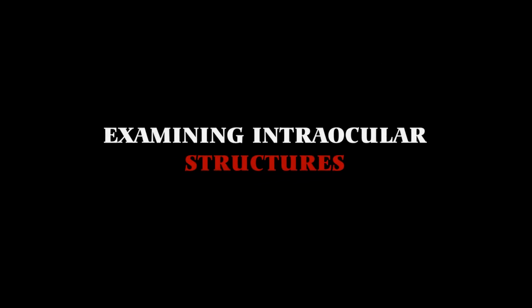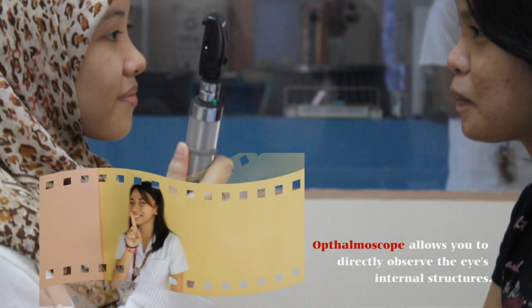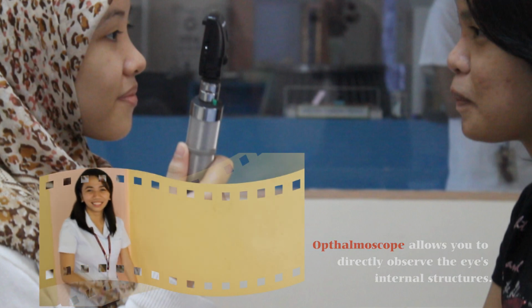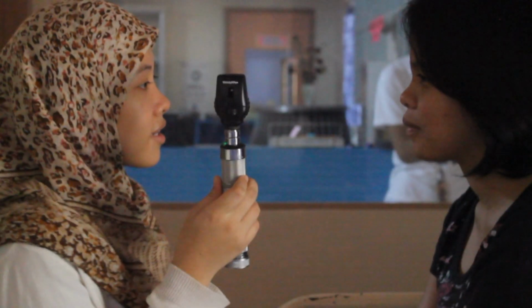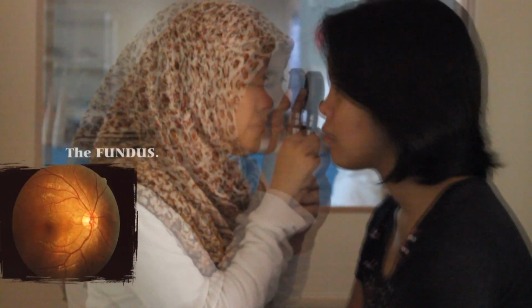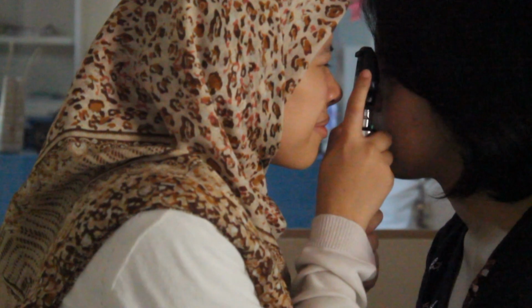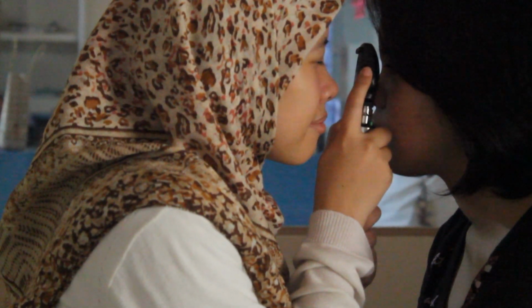Examining intraocular structures. Before beginning your examination, ask the patient to remove her contact lenses or eyeglasses. This is the ophthalmoscope. It allows you to directly observe the client's internal eye structures. Then, slightly darken the room to dilate the pupils. Then, hold the ophthalmoscope at about 4 inches or 10 centimeters from the patient's eye. Adjust the lens so you can focus on the anterior chamber. Look for clouding, foreign matter, or opacities.